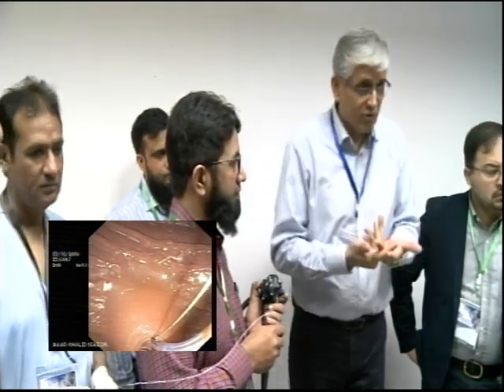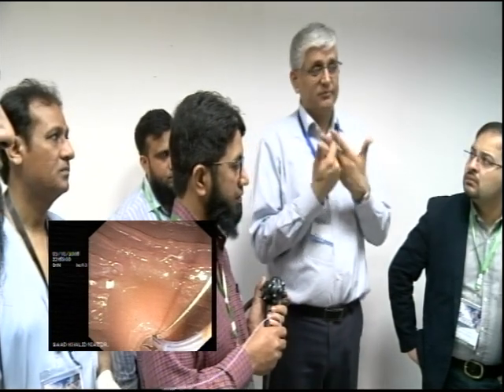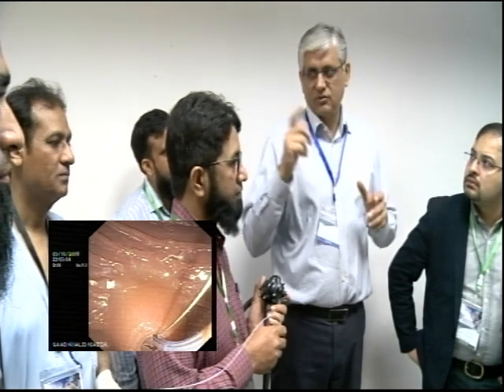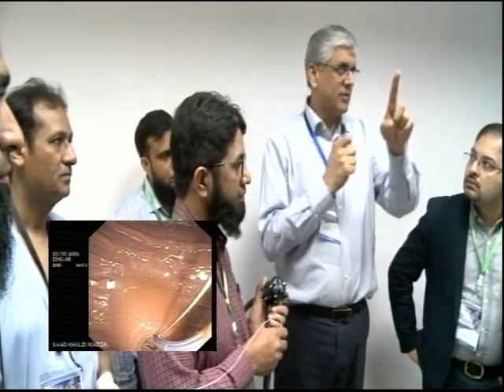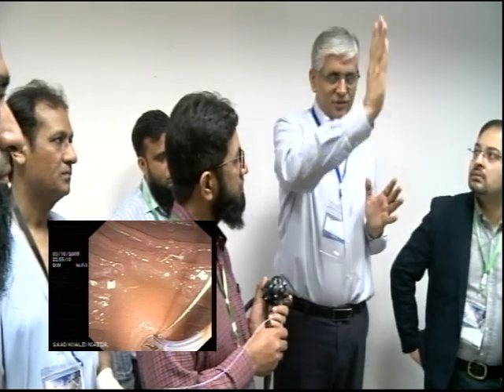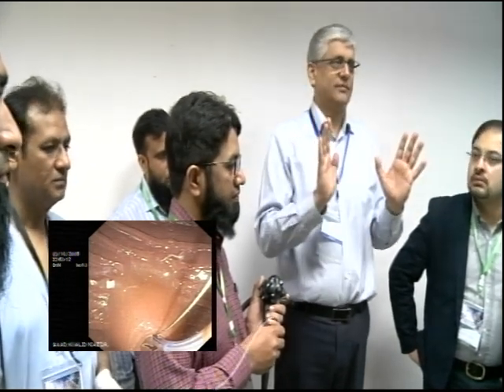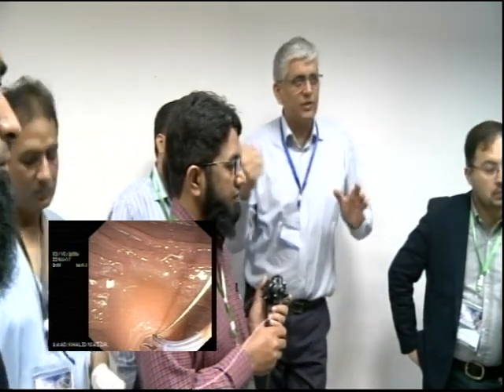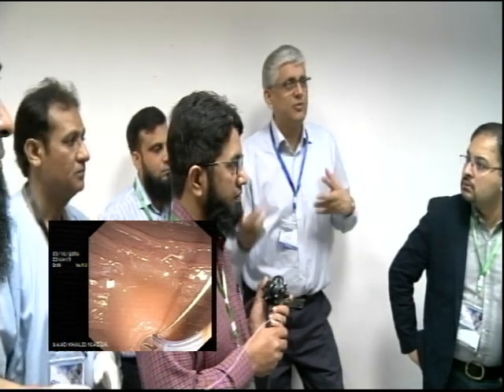So if you're not sure, and this is what I do, I tell them, little dye, possible pancreas. So they will only inject a little bit. We look at the fluoro, and the moment we see it, I don't want the pancreatic duct. I've got the trajectory that I wanted, and that's enough. This is usually when you've done a couple of dyes. So it's important to tell your technician, when I was saying you need to communicate.